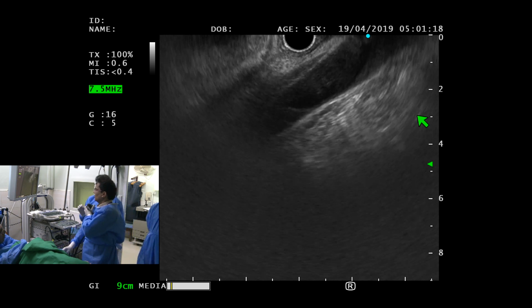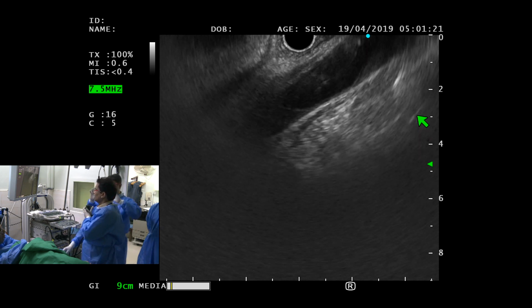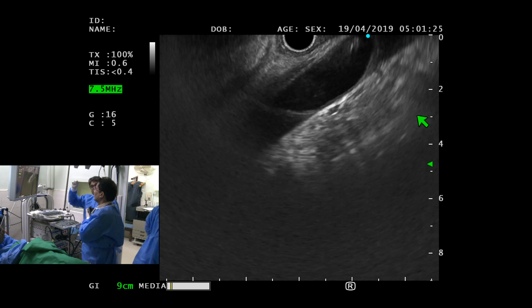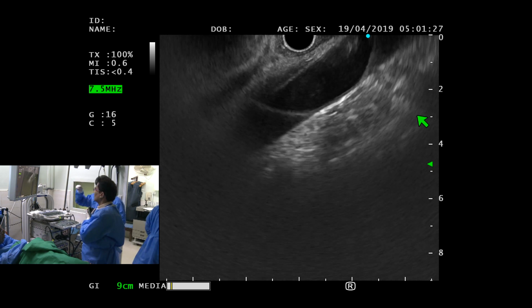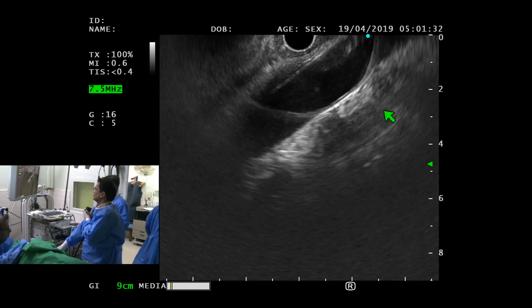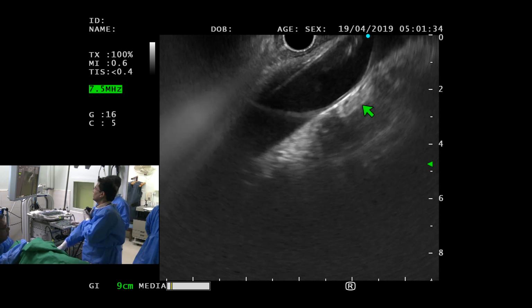Achha, are you getting resistance at this stage? Okay. So trainees in the audience, it's very natural to have some resistance to your right hand as you push the scope. Why? Because हमें पता है कि अब हम GOJ पे पहुंच रहे हैं. You start to see diaphragm coming up there.